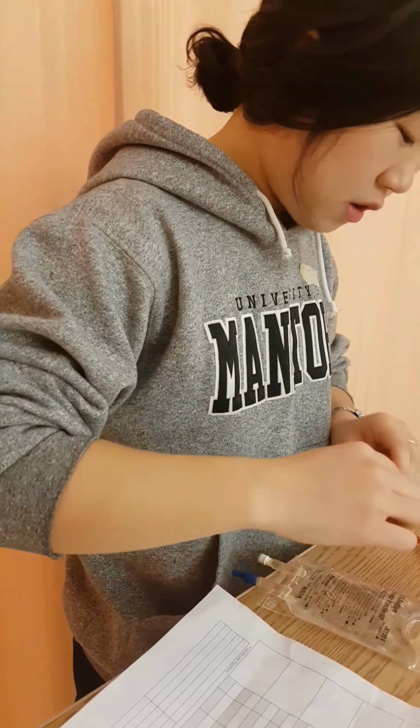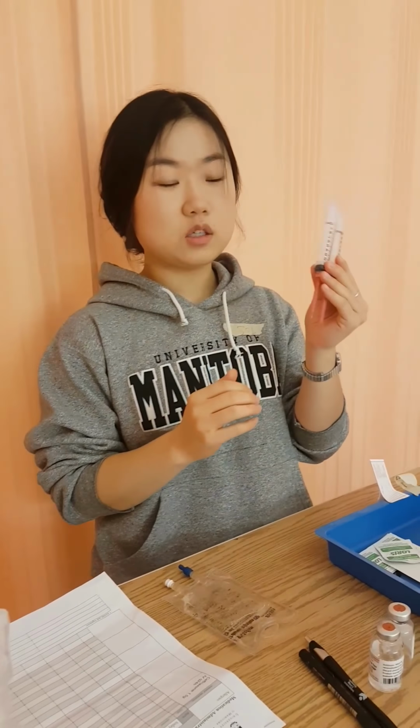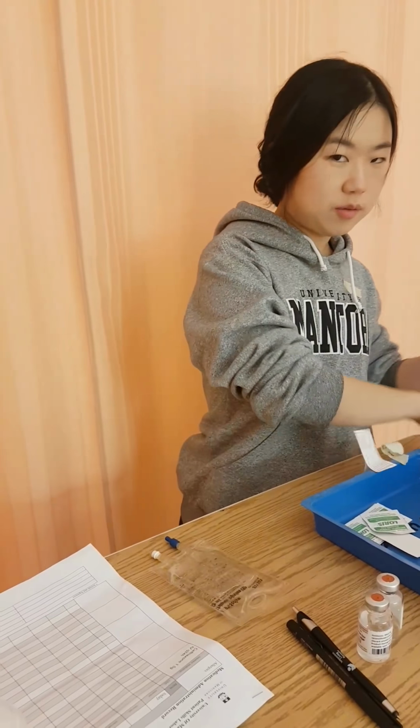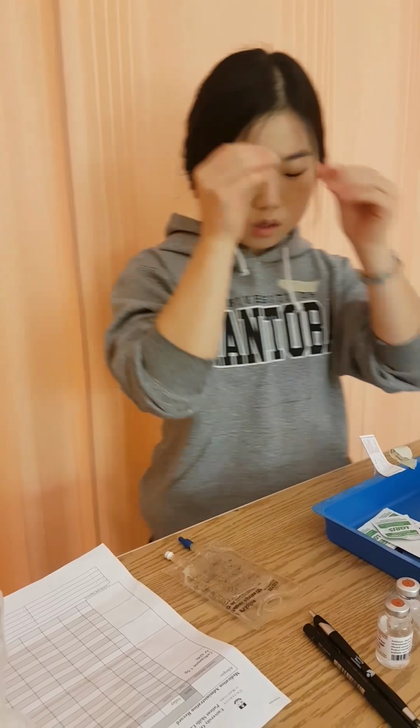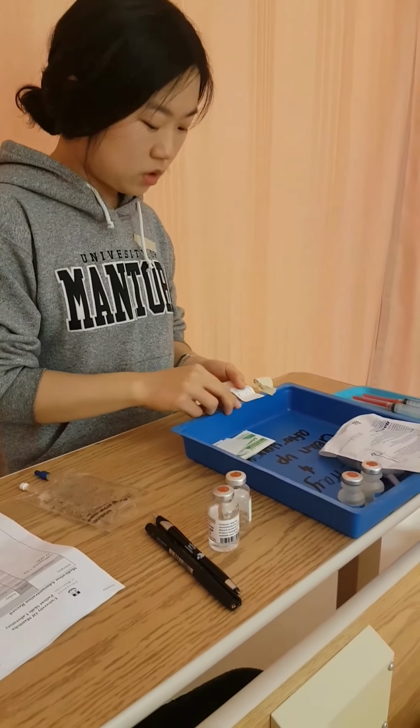Alright, so the total volume in this bag is now 65 milliliters. And I'm going to put these into the sharps container right away. So I put it into the sharps container. And I'm going to label this.